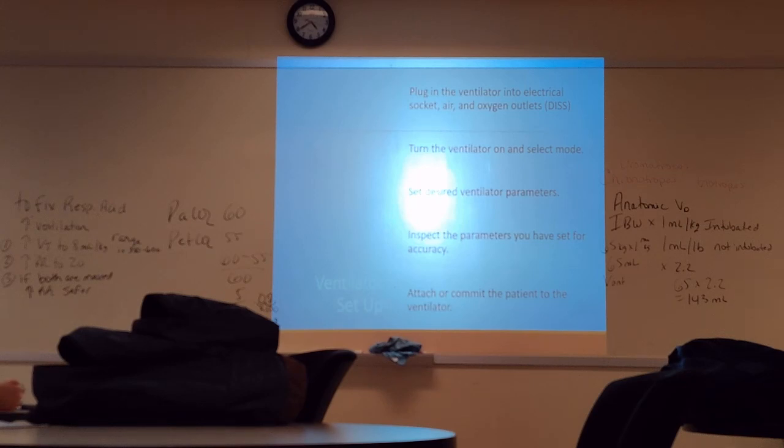So it's like PEP therapy? Kinda, but not in a pleasant, beneficial way, just in a you hate life and you can't exhale kind of way. Okay? I've never used that. I've never played with a vent that had it, so I don't know. But the board still talks about it, so you never know.